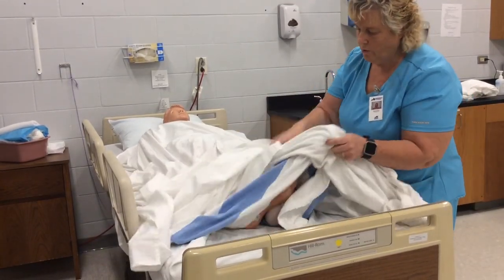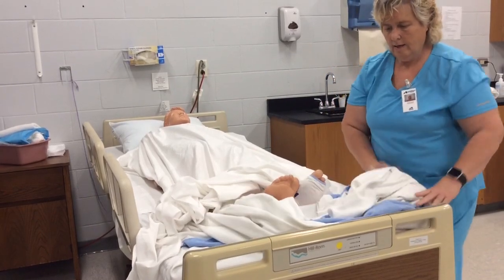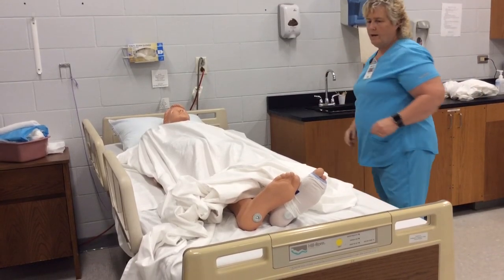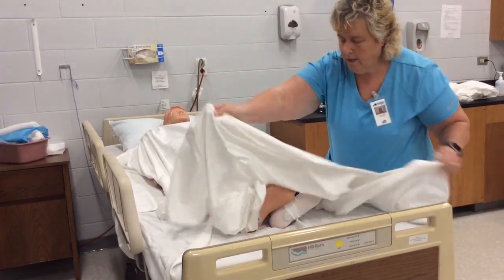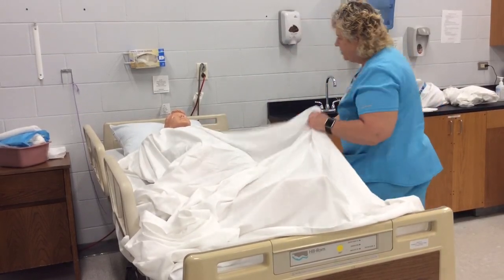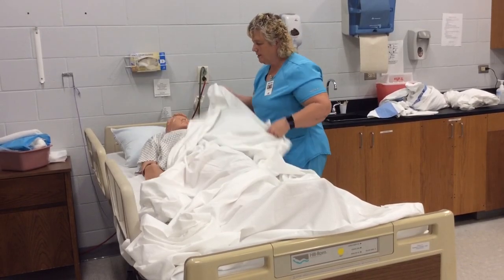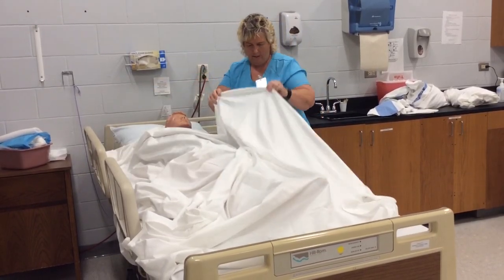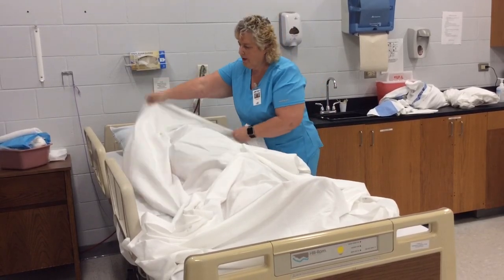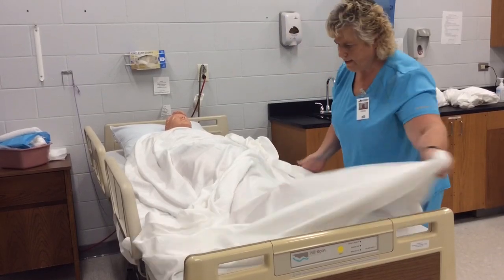So I'm going to show you what I'm doing here. I'm going to roll that, and I'll put that in the hamper. And now I can work on getting my sheet looking nice. Try not to worry about that side till you get on that side of the bed. So let me make sure I've got this straight. There we go. I'm going to make this side look kind of nice, and then I'll work on that side.